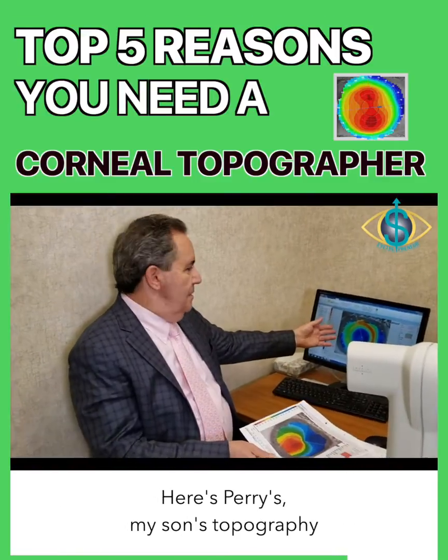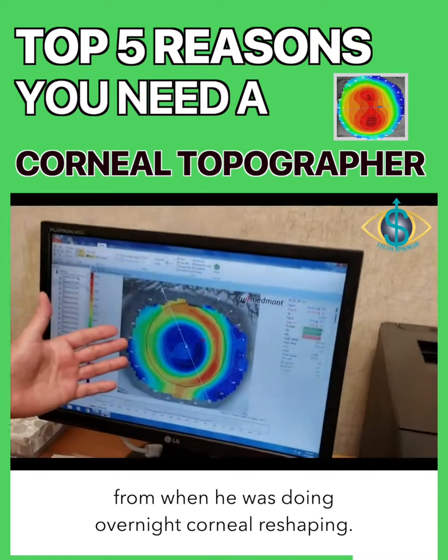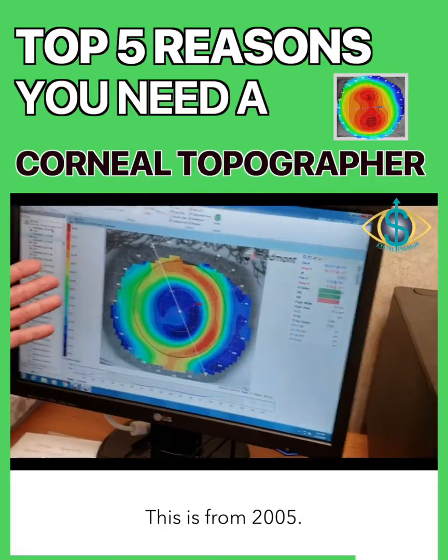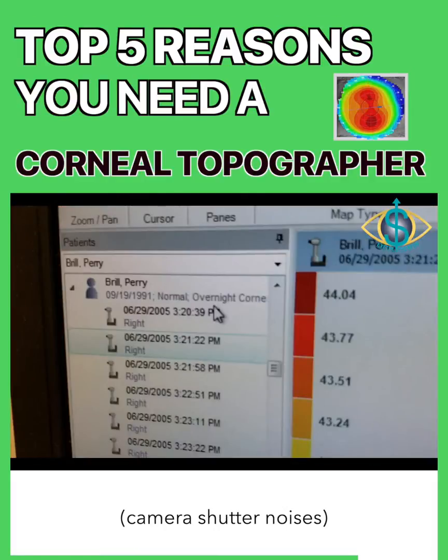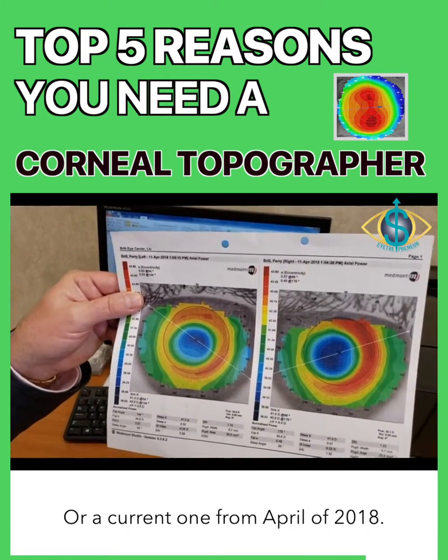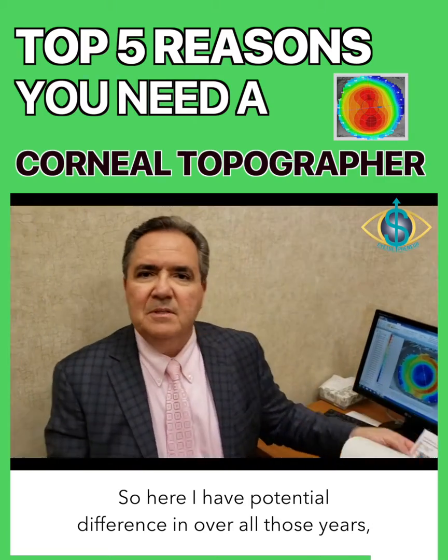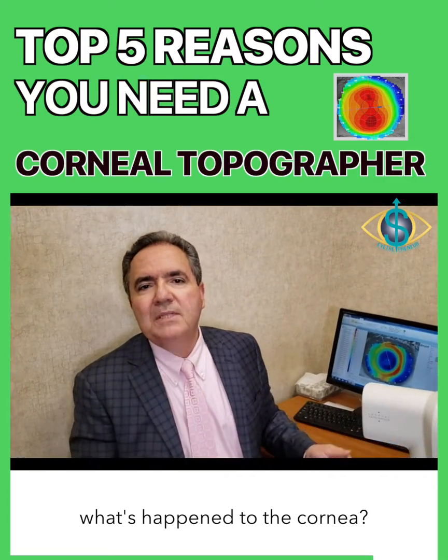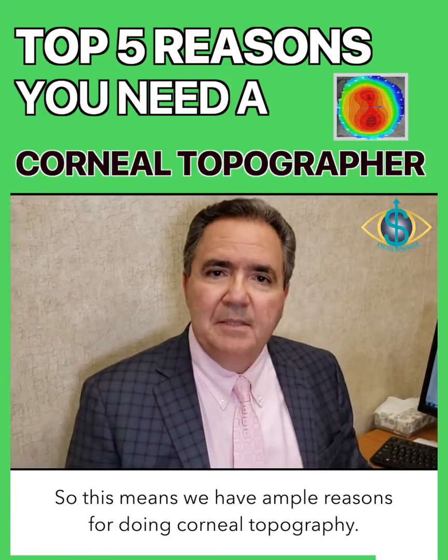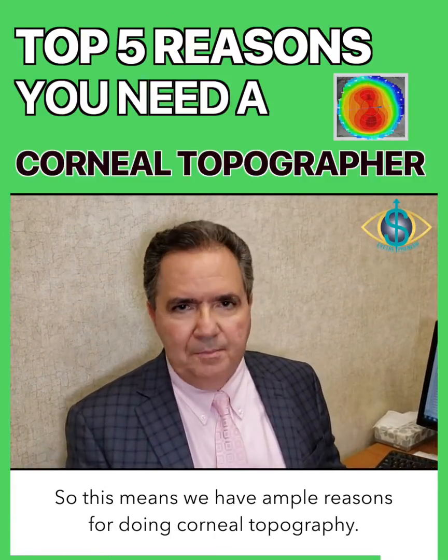Here's Perry's, my son's, topography from when he was doing overnight corneal reshaping. This is from 2005. More current one from April of 2018. So here I have the potential difference over all those years, what's happened to the cornea. So this means we have ample reasons for doing corneal topography.